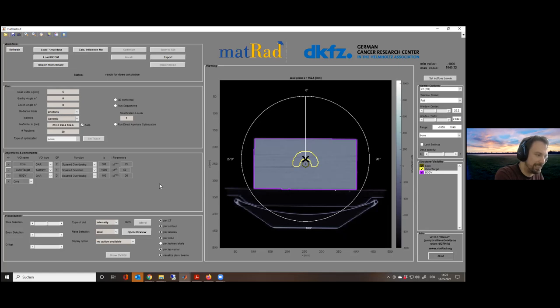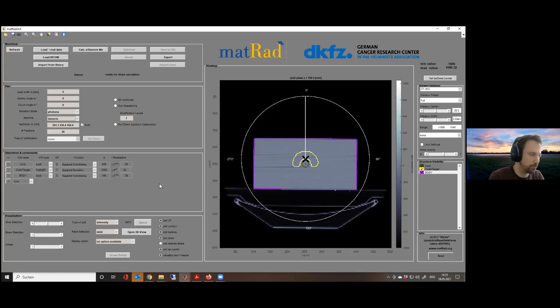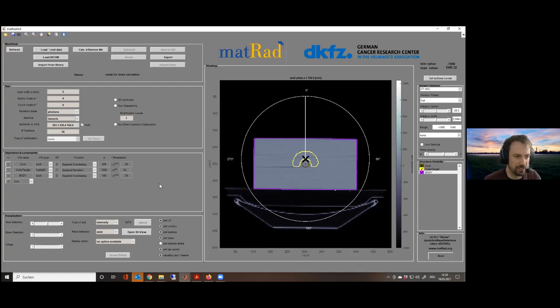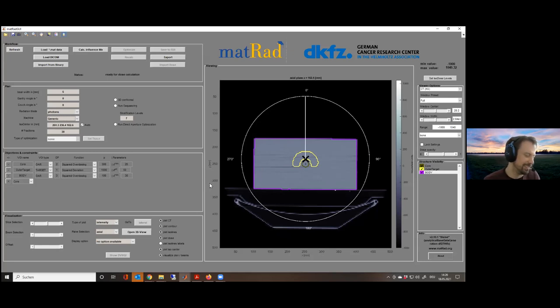Keep in mind that our prescription always considers the total dose accumulated over all fractions, while the dose matRad computes is per fraction. Biological dose computation makes most sense on a fraction basis. So if you prescribe 50 Gy to the target, it gets divided by 30 in your analysis. These are the plan parameters. Other parameters here are photon-specific and don't need to be touched.